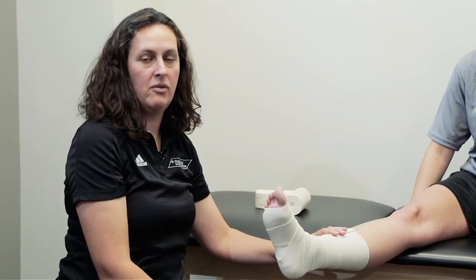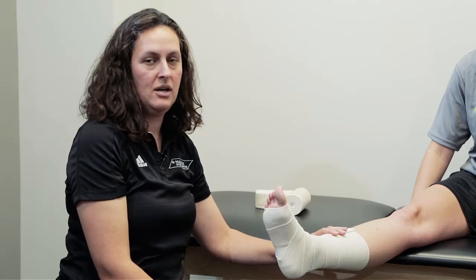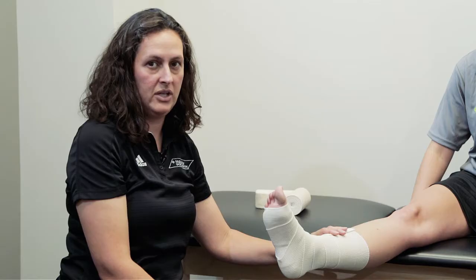This would be the compression piece of our RICE method: rest, ice, compression, and elevation.